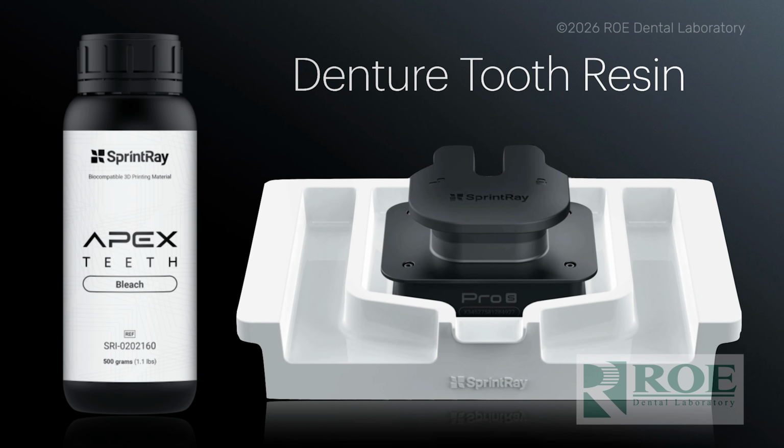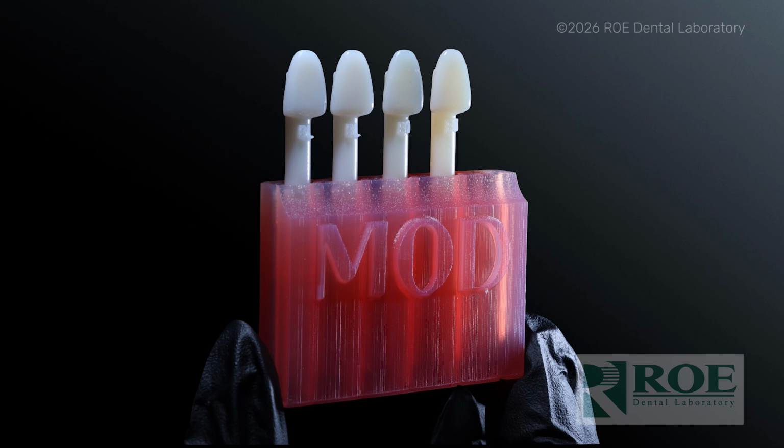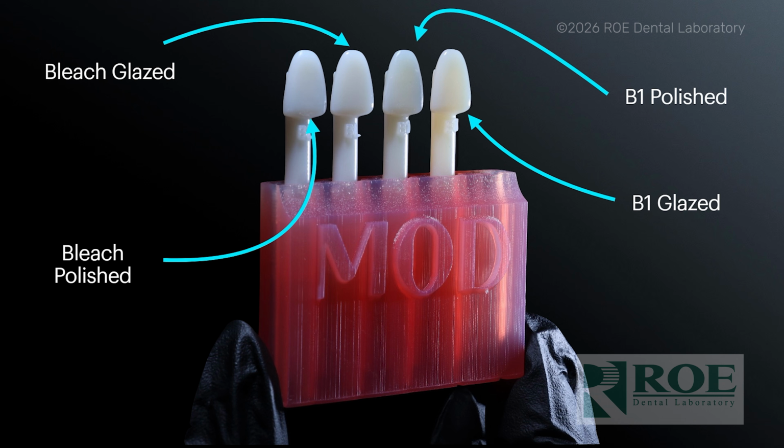I prefer denture tooth resin. Specifically, I love the Apex denture tooth resin. It's so easy to post-process and polish and all that. And so I'll use this, but the other reason I really like denture tooth resin is because now I have shades. I can create these shade tabs. This is a little shade jig thing that Wally Renee and the Mod Institute created. That's a free download. So I'll print these, and what I do is I've got my bleach shades, my B1s, my A's, my A2s, all the shades I normally use in my resins, and then I've got them polished and glazed so that I can do a shade match for the patient. And then I know predictably what I'm going to get.